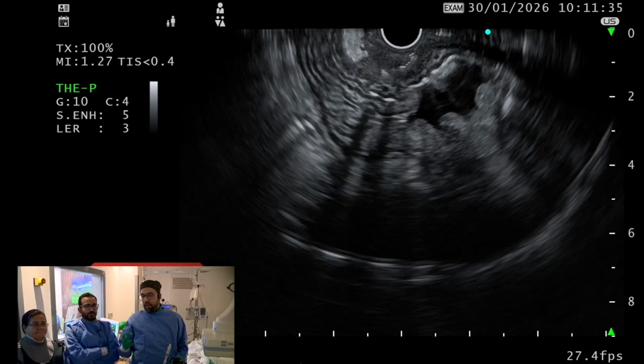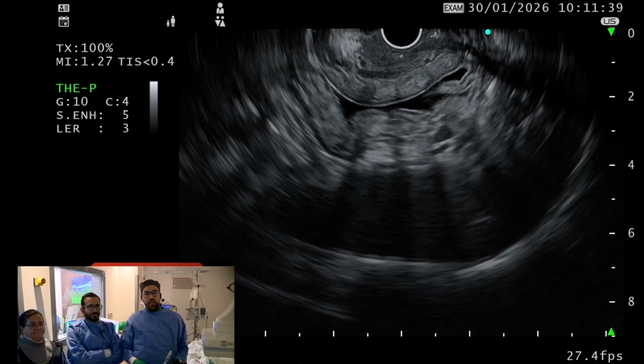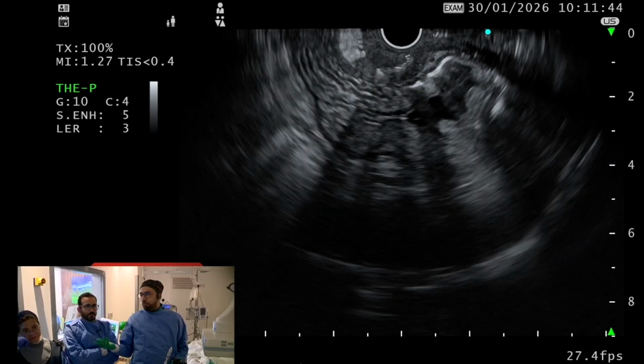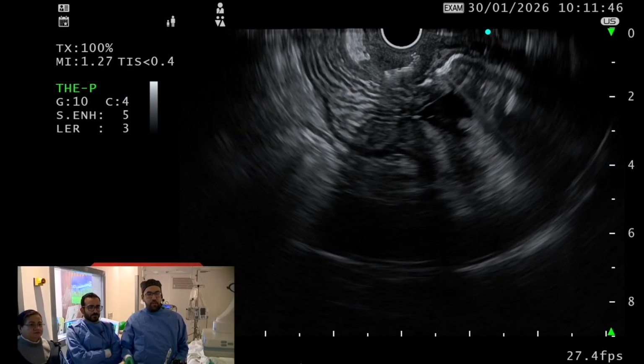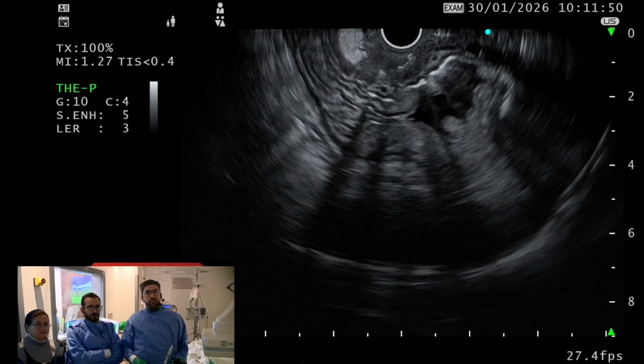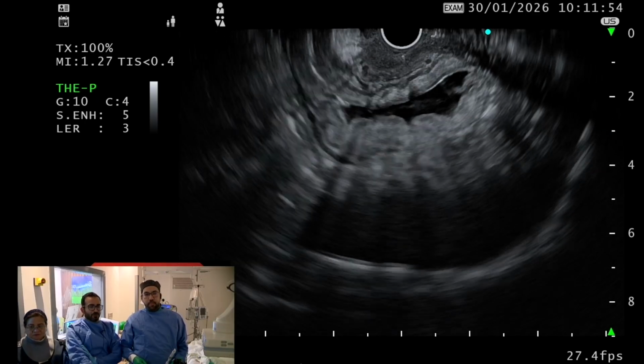If we compare the success of both procedures, EDGE or laparoscopic, they are almost the same. But in case we need a lap chole, we can consider laparoscopic assist. Otherwise, we have to avoid the invasiveness of the laparoscopic approach. And maybe Nawaf, we can just show them the endoscopic view.